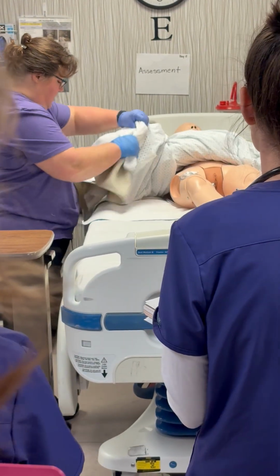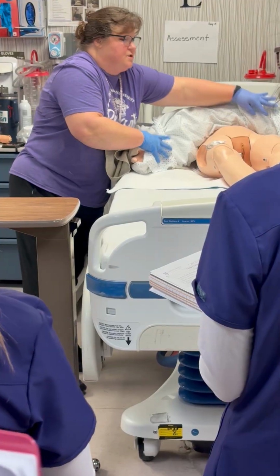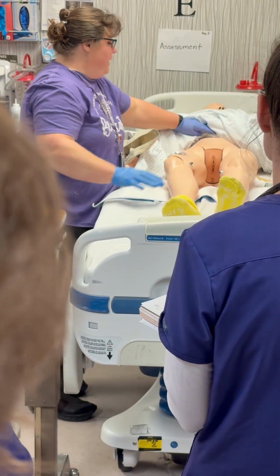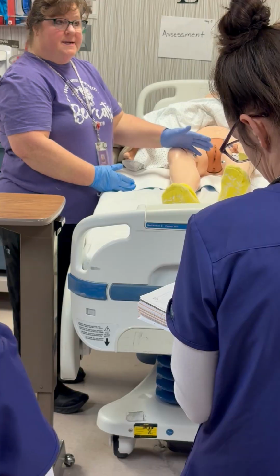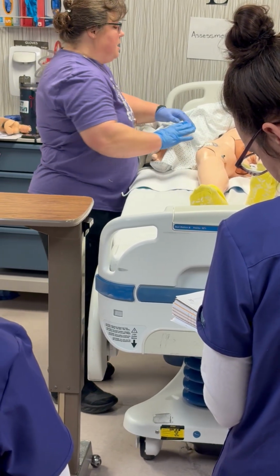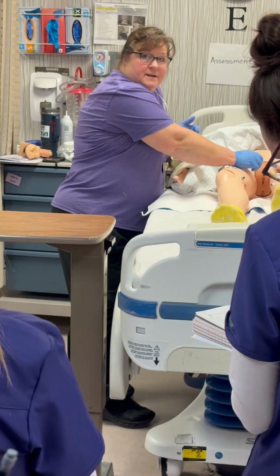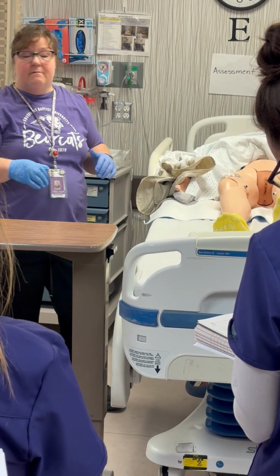Okay, and where does my peri-care exist? Where do I wash from for peri-care? Everybody know? Front to back. So, it's from the belly button, abdomen, down to the knees. That's where you should be doing pericare, okay? So, abdomen, inner thighs, peri area, like you're supposed to, right? And then the anus last, okay?